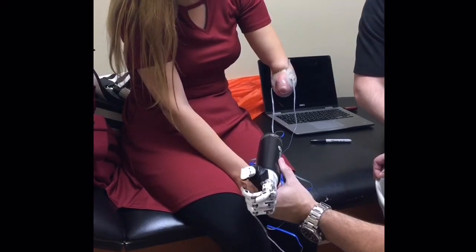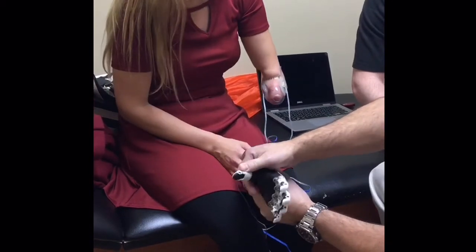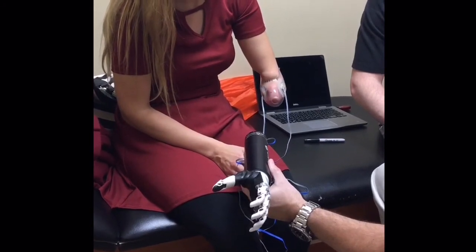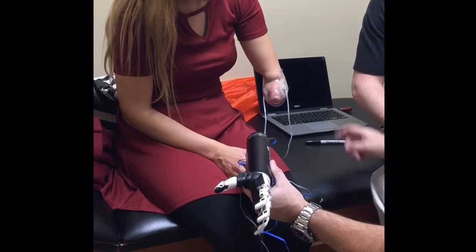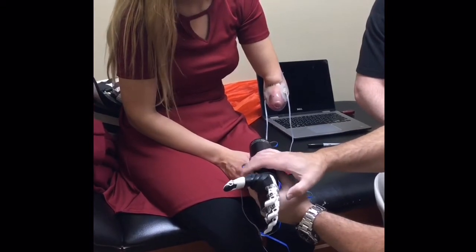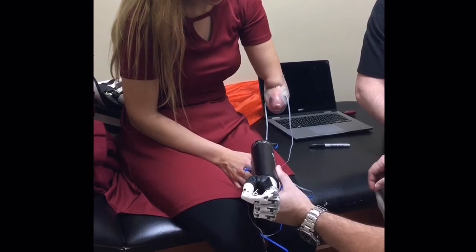All right, so now I'm gonna put the thumb opposed. Now do it. Now open. Now I'm gonna go press the back. Now in the next four stages — that's the trigger finger.